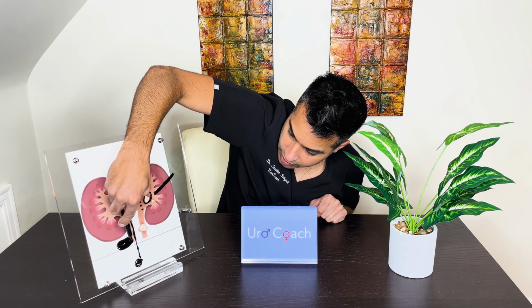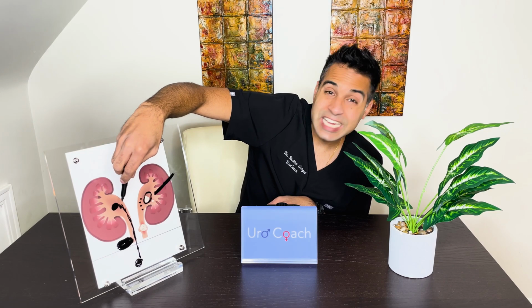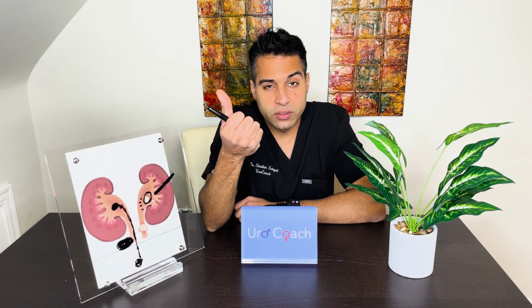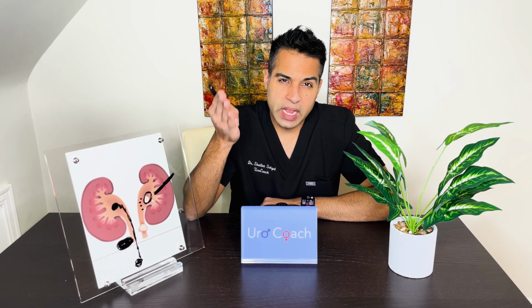And when it pushes on that ureter, it squeezes it. Urine's not able to get through, and then you get swelling of this kidney. Well, a stent can liberate that urine from the kidney down to the bladder. So we'll place a stent in individuals oftentimes with certain cancers that have nodes or masses that are pushing on the ureter, and we'll keep those stents in place until those cancers have gotten better, until we work with the oncologist to figure out a good time to take those stents out.